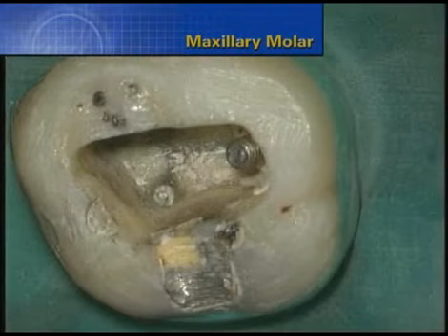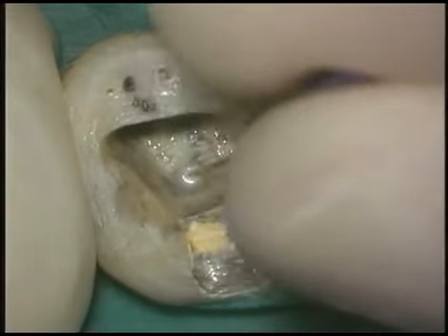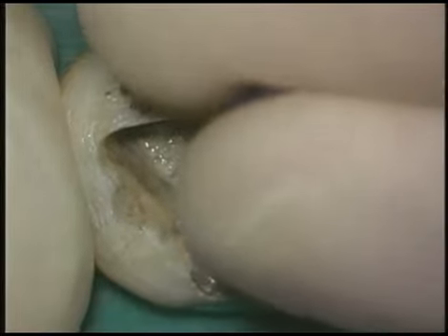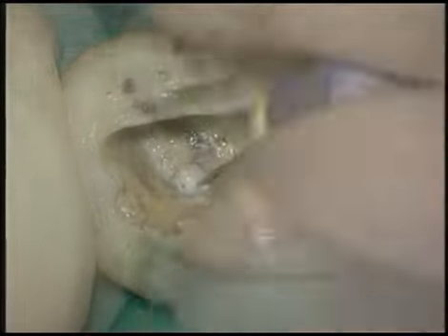Here's a maxillary molar with a sectioned silver point in the DB root. The removal procedure was performed live during the Chicago Midwinter meeting. Use small hand files in the presence of a chloroform solvent to remove cement and progressively create space lateral to the obstruction. As we progressively pick in short amplitude strokes, the tin file will progress deeper into the canal.